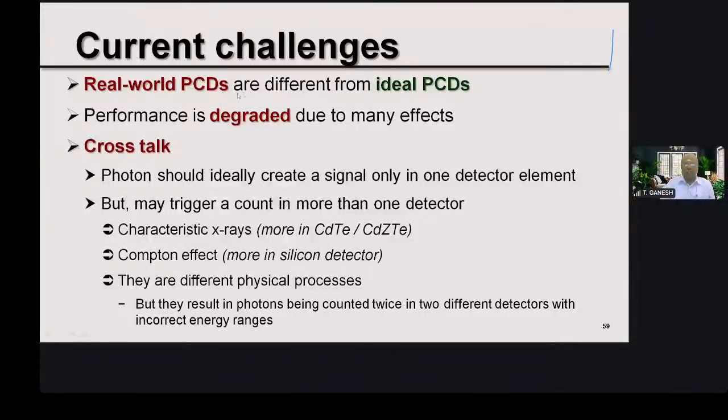The real world PCDs are different from the ideal PCDs. Whatever we have seen are ideal PCDs with ideal performance, but the real world is much different from that. So the performance is degraded due to many effects. There is something called crosstalk.